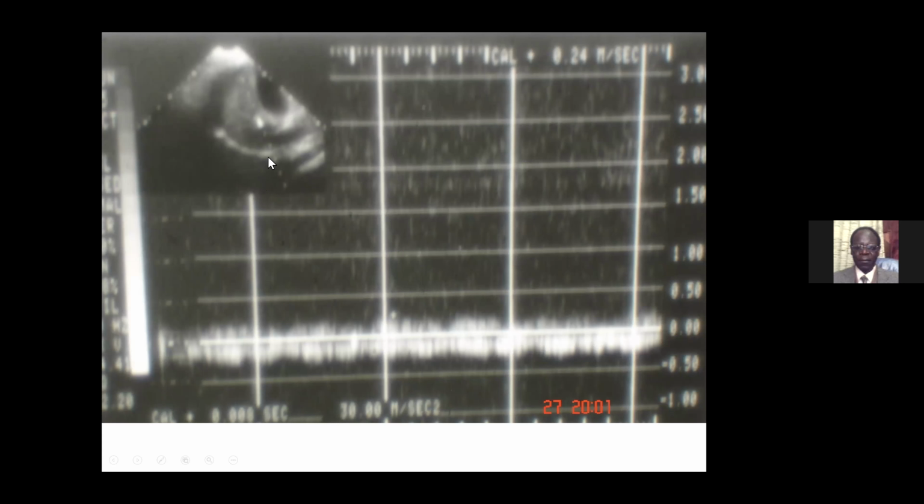This one again is a duplex Doppler. This one shows two veins. The one below the axis here is a hepatic vein because we can see the undulations. But then there is another one flowing in the opposite direction, which is a smaller vein.